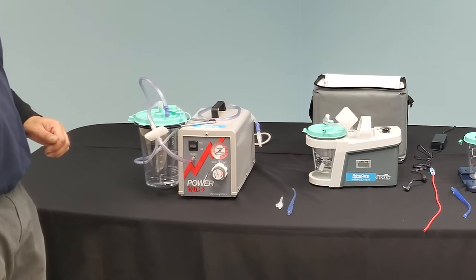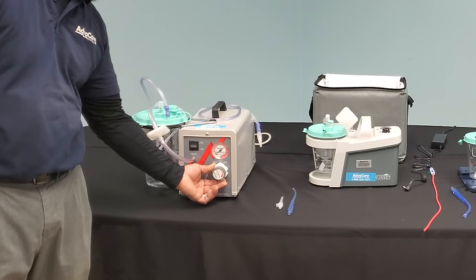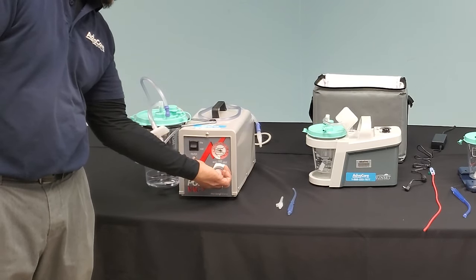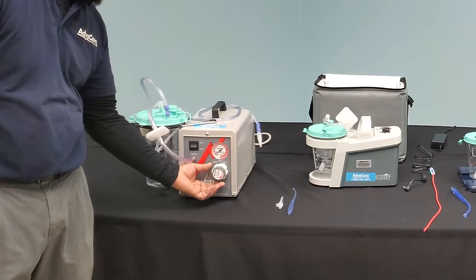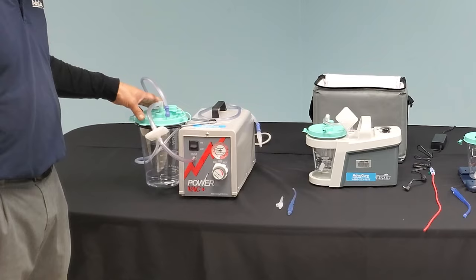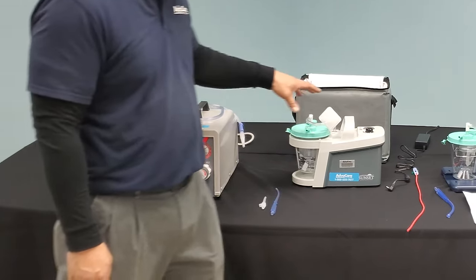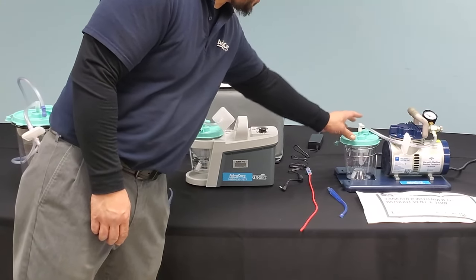After initiating power, you have two separate control knobs. The white knob allows you to select regular or INT for intermittent suction. On the regular setting, the machine acts as a continuous suction machine — providing continuous suction pressure just as a portable or stationary suction machine would.